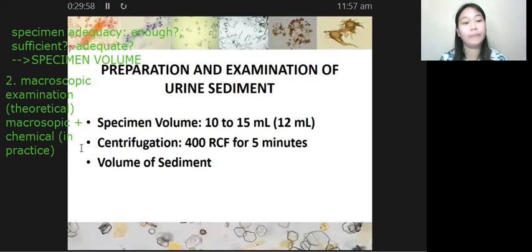So remember, ang daming remember. Okay? So tandaan po natin. Pag magpa-perform ka ng microscopic analysis, ise-centrifuge mo, and then what do you do with the supernatant, doon sa fluid na na-form above your sediment? Ano ang ginagawa natin? Dinedecant. In short, tinatapon natin. Okay?